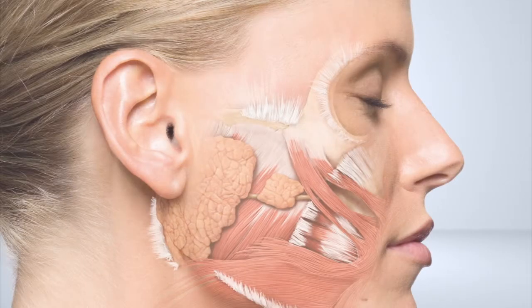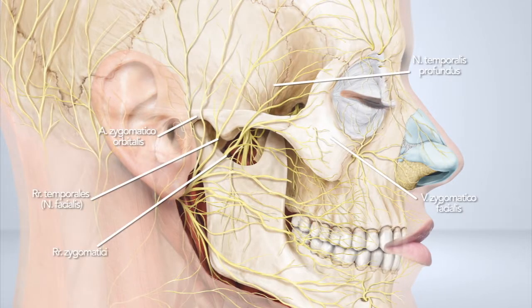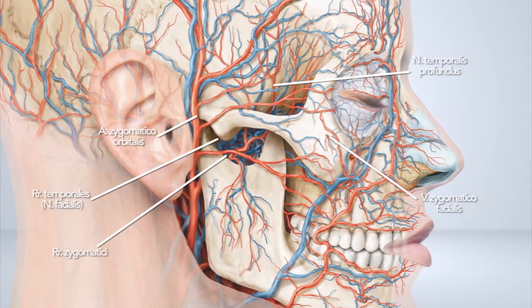The main anatomical precautions for the injection are the auriculotemporal nerve, which is a deep sensory branch of the mandibular nerve, which goes into the infratemporal fossa and whose main branch extends posteriorly to the injection zone. The frontal branch of the facial nerve, which crosses the fold to be injected. It is located in the superficial temporal membrane. Superficial injections can deposit the filler in very close proximity to this neural branch. Deep injections in the temporal muscle are not made close to the frontal branch. It is very rare that a neural branch is damaged by a fine needle or cannula.